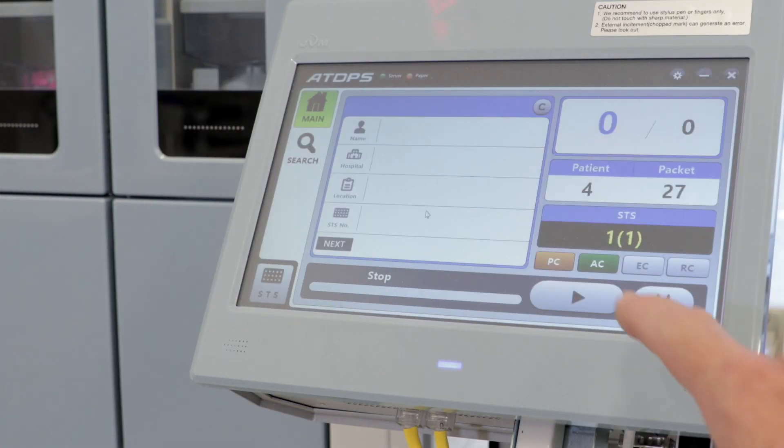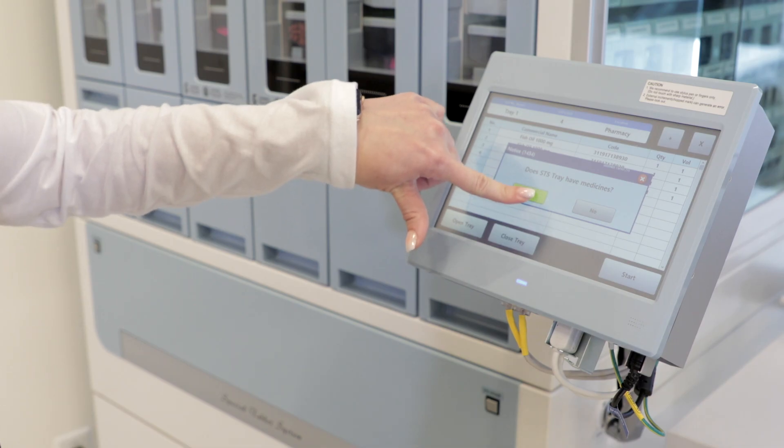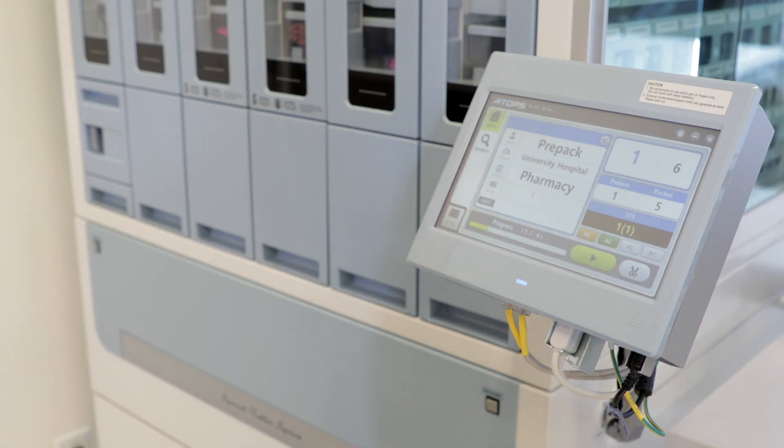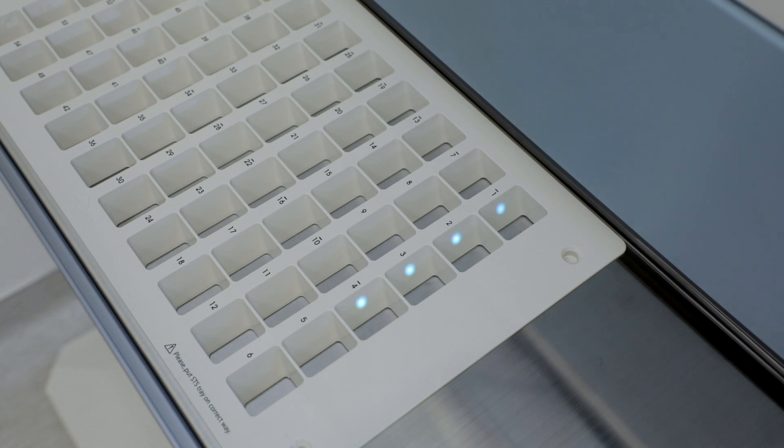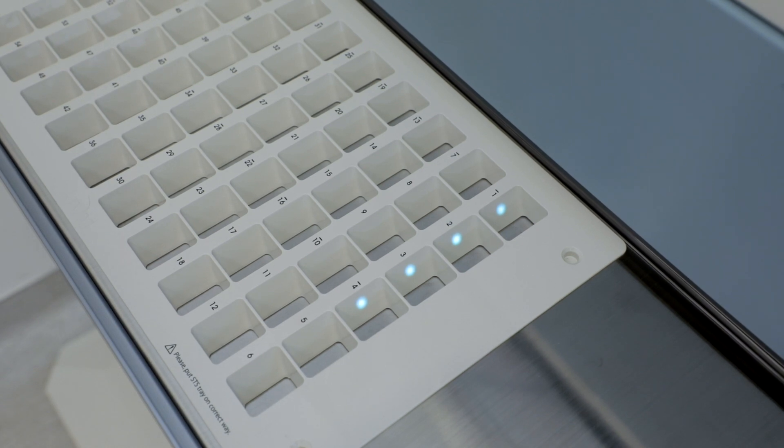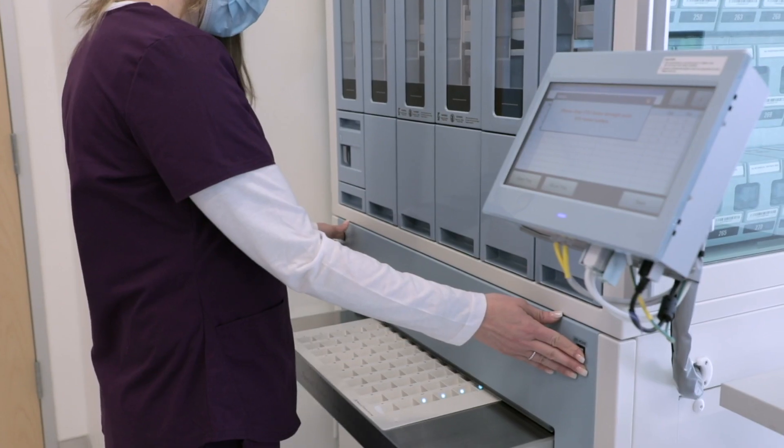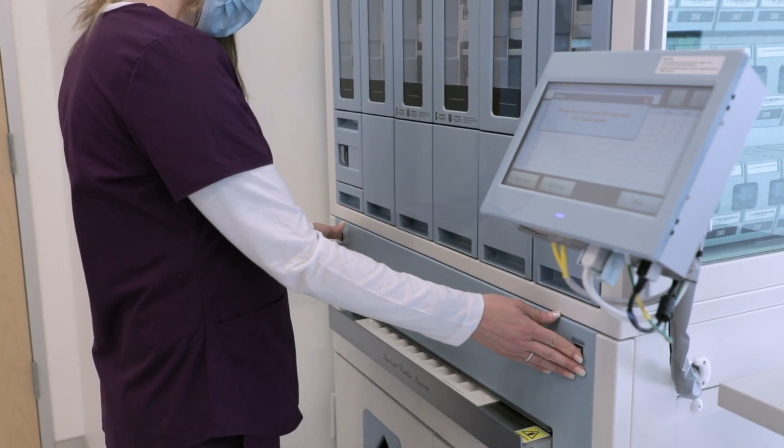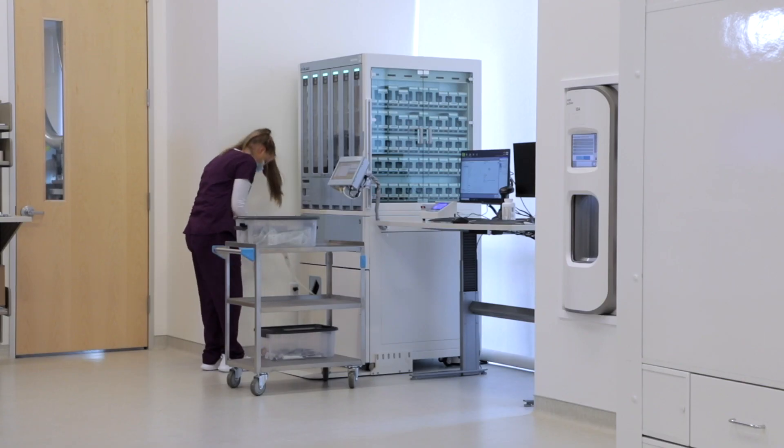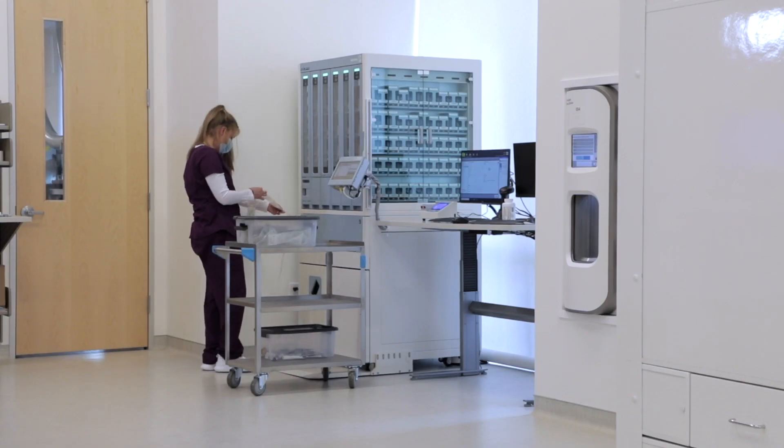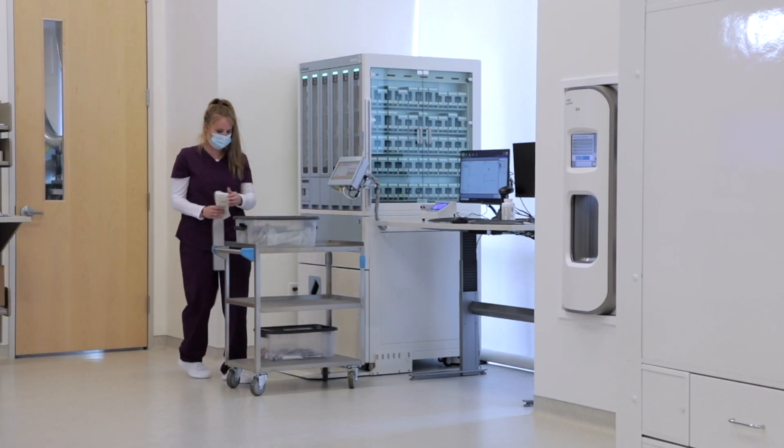The user clicks Start on the Packager screen and follows the directions to fill the STS tray. The LED indicator on the tray facilitates accurate filling of non-canister medications by directing the user to fill the correct cell in the tray. The user closes the STS tray and completes the process to package the medication. The medication pouches are then generated by the AutoPak system.